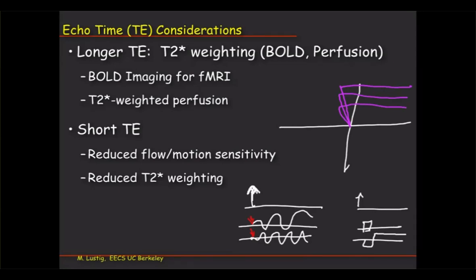Of course, you can also do radial acquisition and other things like that, but that's a very common thing to do. And scanners will have an option to have a partial echo, and you can tell the scanner how partial the echo should be, 60%, 70%, 90%, and then your TE can change.